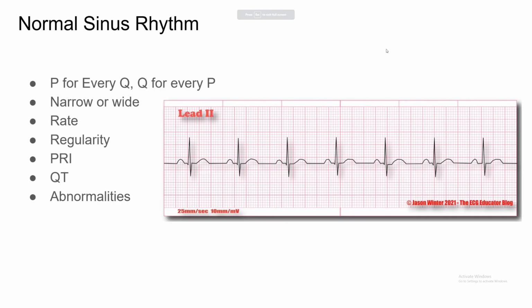All right. So before we start talking about cardiac dysrhythmias and how to read a 12 lead with a cardiac dysrhythmia and how to analyze it, let's take a look at a normal sinus rhythm first. Perfect normal sinus rhythm, right? So this right here is a fantastic example. I know we don't have a 12 lead, but we can just take at least a look at this one lead right here for reference. So I'm just going to teach you real quick how I read a 12 lead. This is how I was taught, and I think this is the way that most people read a 12 lead.